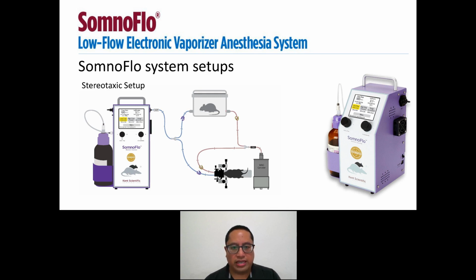One thing that I will say is that between the SomnoFlow and the Somno Suite, you'll notice that the SomnoFlow only does anesthesia. That was its main purpose. Whereas the Somno Suite does the anesthesia, that's its main function, but with additional modules, depending on what your applications and procedures require, you can add those on as well, such as SpO2 monitoring, end-tidal CO2 monitoring, ventilation as well.